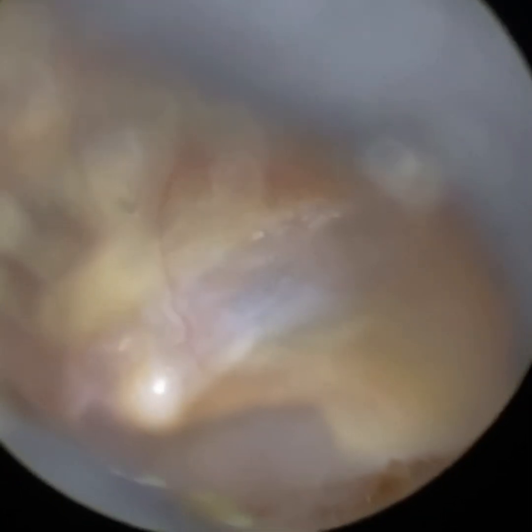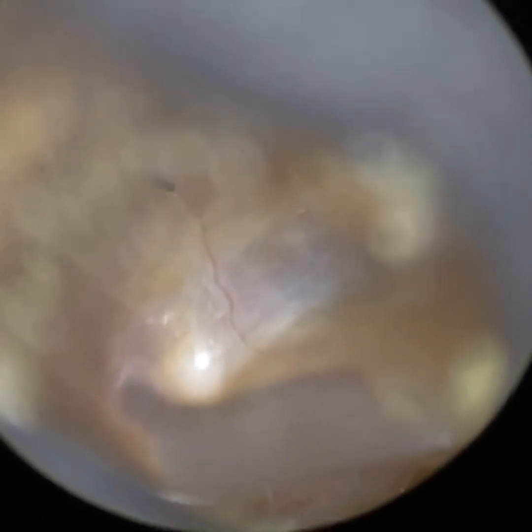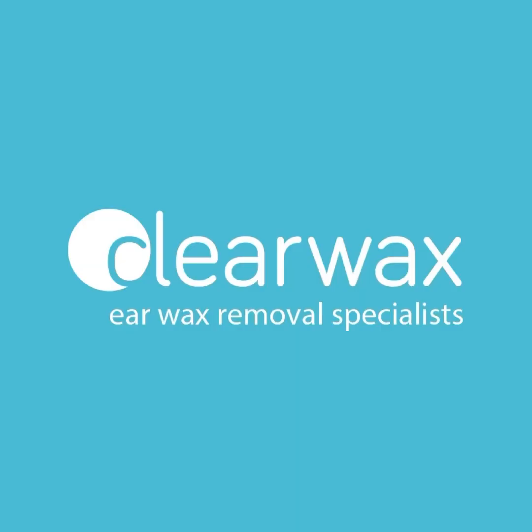Just going to get the eardrum in focus. There we are — nice and healthy left ear. I hope you enjoyed that video, and as mentioned, if you are interested to learn more about the Waxscope and be added to our mailing list, please email info at clearwax.co.uk. Thank you. Bye.